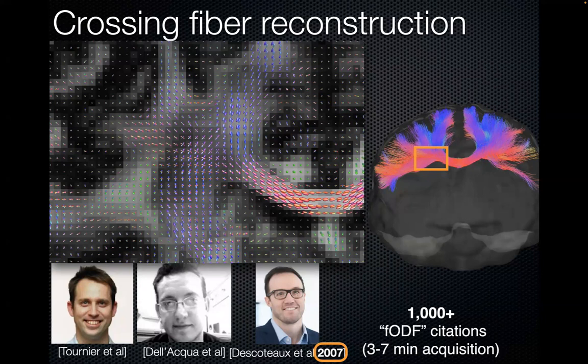Of course, suddenly you have 2 or 3 tensors. So instead of just 6 unknowns, you have 15 to 20 unknowns to fit. The images are still noisy, and as a bonus, you would want to be a little bit more specific to intracellular, extracellular water. So there's no free lunch. This comes at a price, and typically nowadays it's a 10-minute acquisition. When we have clinicians that say 10 minutes is too long, I cannot keep my patient in for 10 minutes.